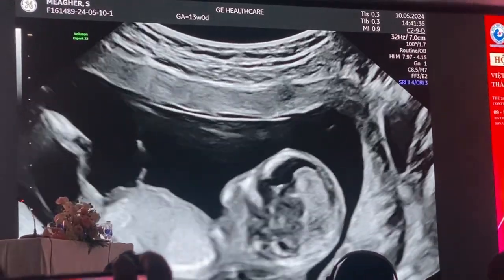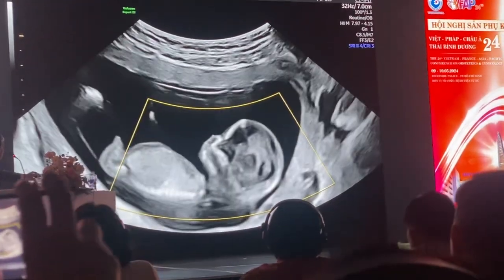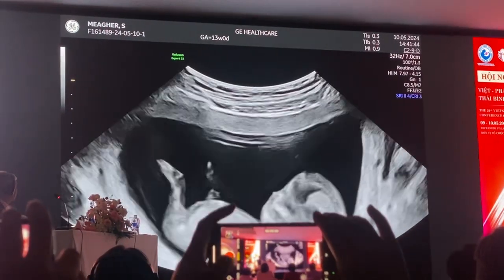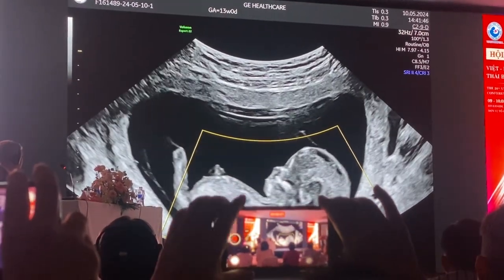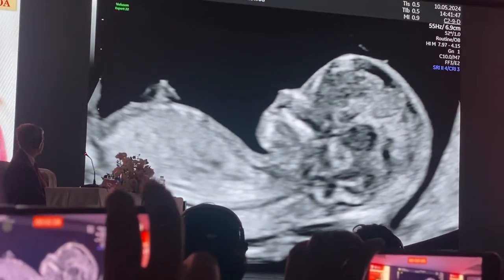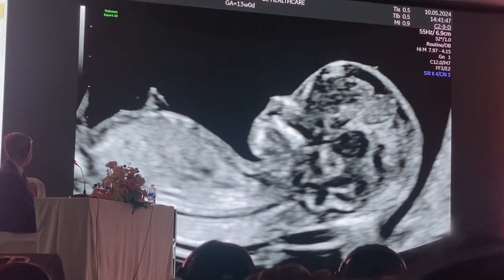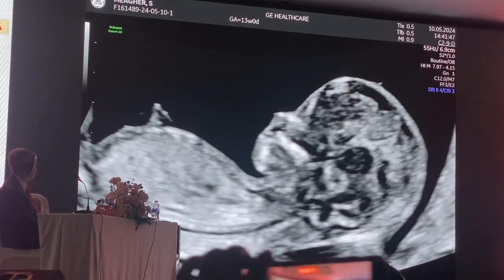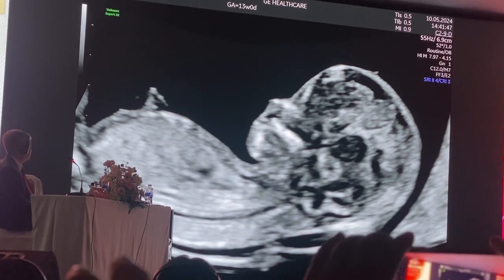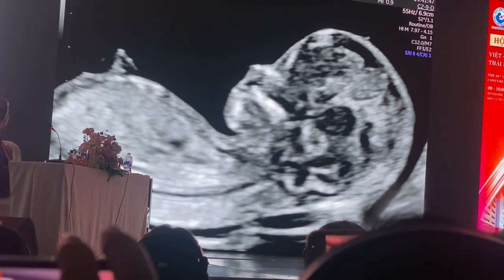When I look at the baby in a sagittal section, if I want to take a nuchal translucency measurement, I have to get my magnification so it meets the ISUOG guidelines. So if I look at that measurement, I'm going to slightly increase my dynamic range just to increase the contrast. I then can select my image. I just go to image select, and then for the image I can toggle it very, very slightly so it's occupying more than 3/4 of the screen.